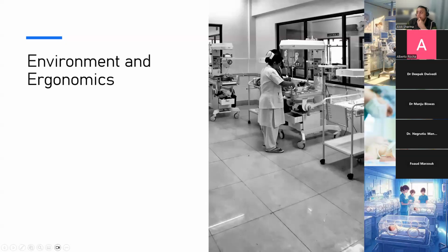I do have no space on the left-hand side either, because everything's kept over there. So one option is that I move this whole chamber where a baby is receiving phototherapy, which is not such a good idea. But there is another option, from my perspective, of putting the machine here and actually holding and viewing the machine, but doing the ultrasound backwards. And a simple example that I'd like to give you is the view that you're going to see now.